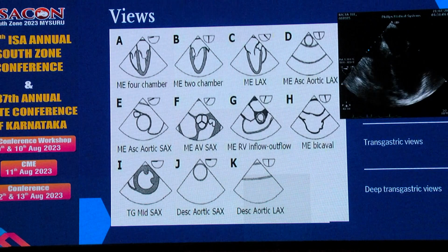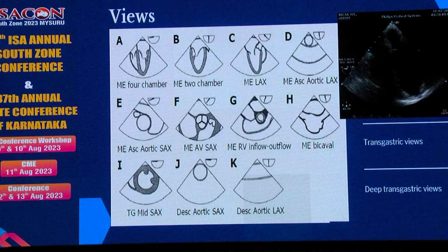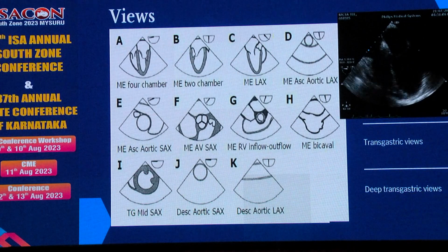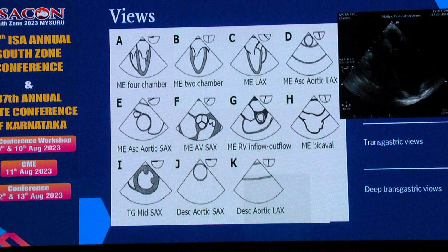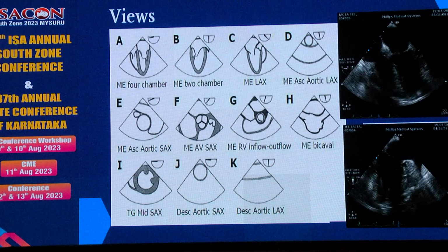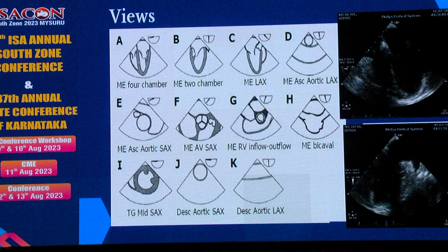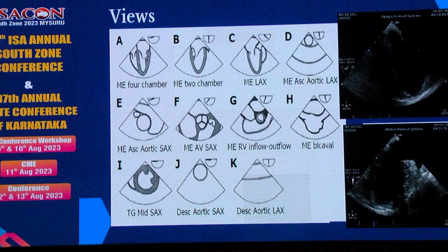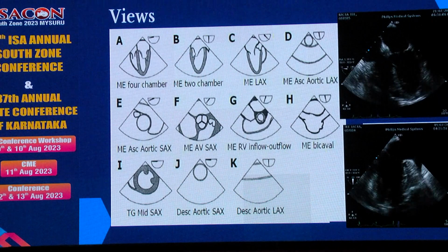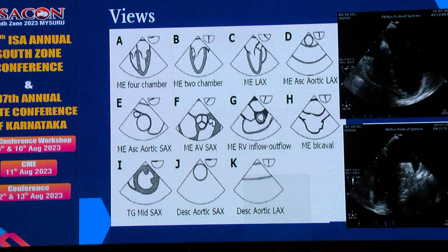So this is the 4-chamber view, and then once you increase the multiplanar angle, what you can see over here, I don't know the pointer, that semicircular one indicates the angle rotation from 0 degrees to 90 degrees. Now I increase the angle, and this is what I get. At around 60 to 90 degrees, I get a 2-chamber view. The heart is cut exactly perpendicular, so it is the anterior wall and the inferior wall which get cut. This is called a 2-chamber view.